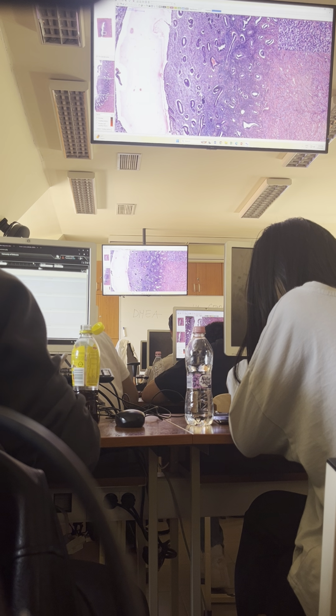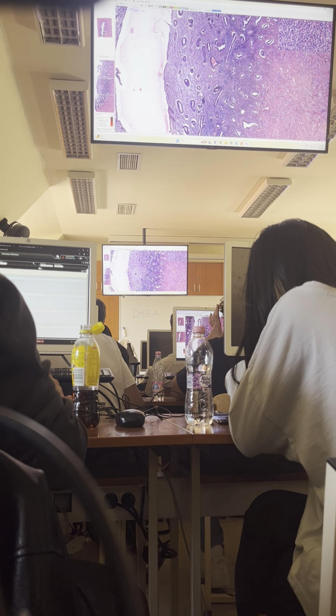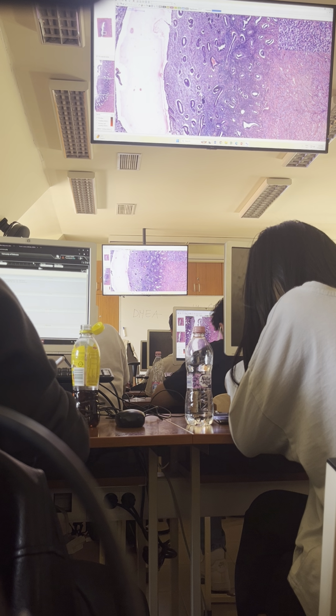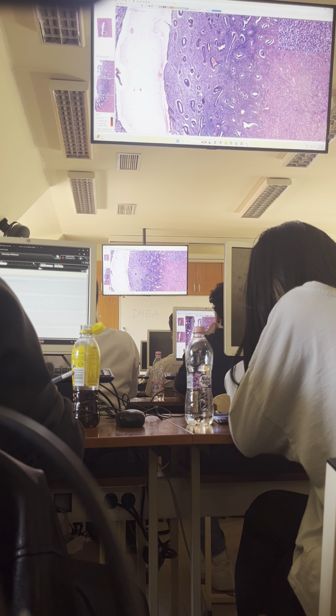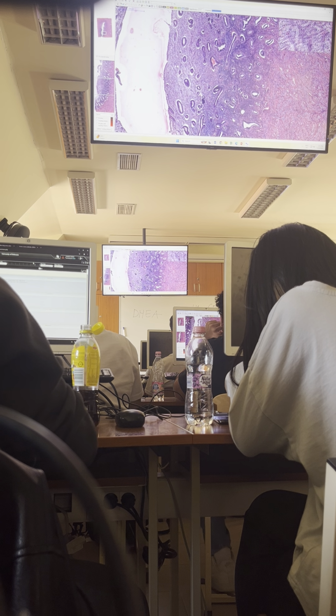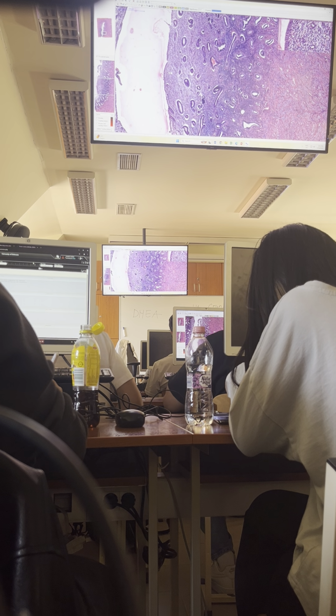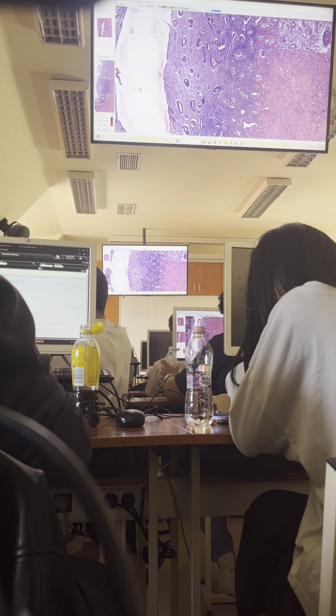However, yes. We can differentiate the functional layer into two further sublayers only in the progesterone phase, not now, because there is no way how we can differentiate here. Okay.